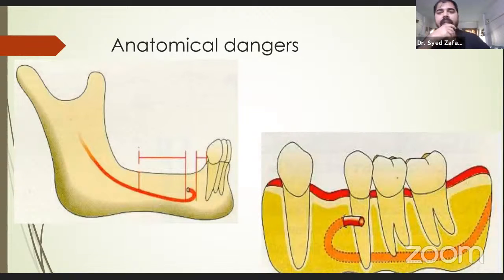Anatomical marking, and what size, what diameter will you place? If a patient comes to you with an OPG, mostly in our country patients usually don't go for CBCT as it is expensive, so mostly they come with an OPG. Almost 50 to 60% of patients are assessed on their OPGs, so all the reading, all the assessment we do on the OPG. If a patient comes to you with this case, you mark with the scale. I'm assessing there is almost 13 mm.